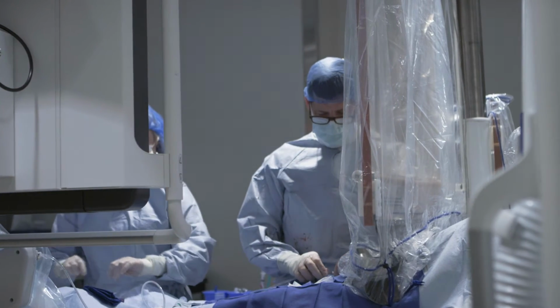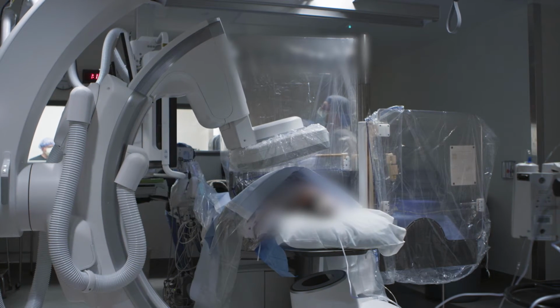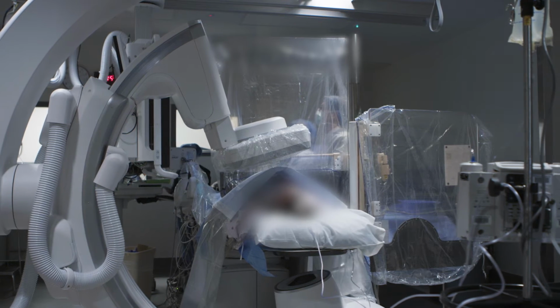As time goes on, once barrier technology is an accepted technology, I think that will go very fast. But until then, we still have to plow that ground of acceptance, so that people are okay walking into a room without their lead apron on. And the only way that you can do that is through data, showing them that, hey, listen, this is the data: with the lead apron, you're getting this, and your exposed body parts are getting this.